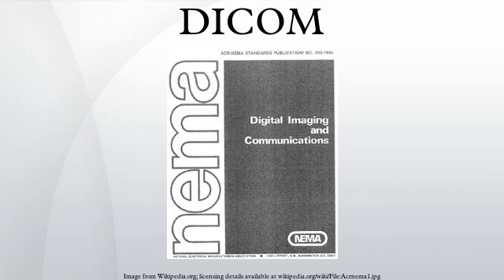Another example is NM data, where a nuclear medicine image, by definition, is a multidimensional multi-frame image. In these cases, 3 or 4-dimensional data can be encapsulated in a single DICOM object. Pixel data can be compressed using a variety of standards, including JPEG, JPEG lossless, JPEG 2000, and run-length encoding. LZW compression can be used for the whole dataset, but this has rarely been implemented.